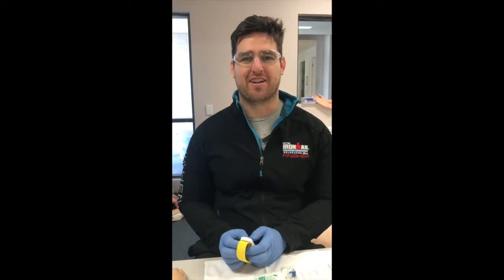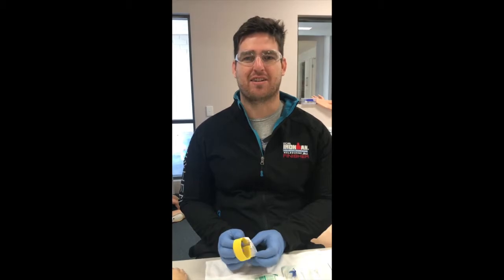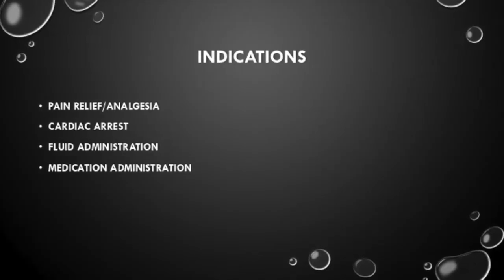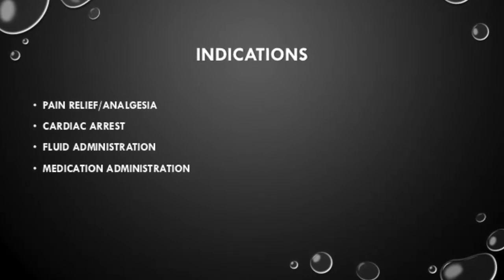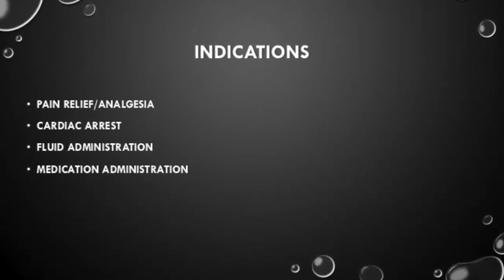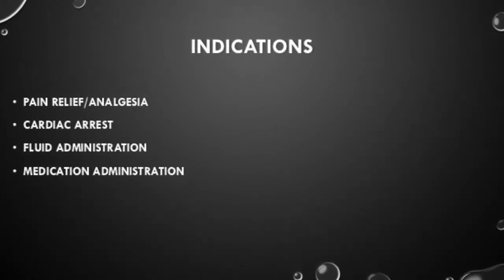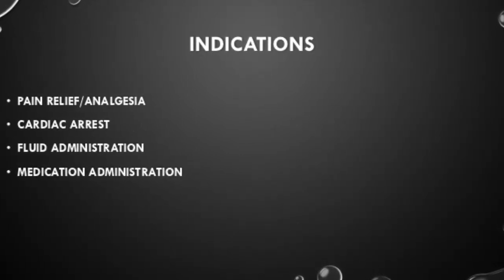Hi, I'm Matt Collins, and today I'm going to be performing paediatric cannulation. Indications for IV cannulation of pediatrics include pain relief, cardiac arrest, fluid administration, and also medication administration, for example, dextrose, adrenaline, and antibiotics.